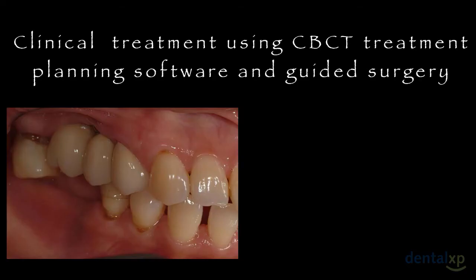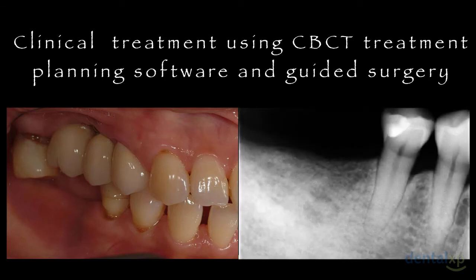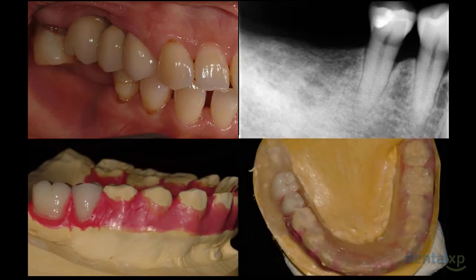So how do we look at this for patients in this technique? Well, first, we need to look at patients and do our traditional treatment planning in regards to where implants need to be, and initial treatment planning for that patient. As we look at this, we can then make impressions to create a radiographic template.